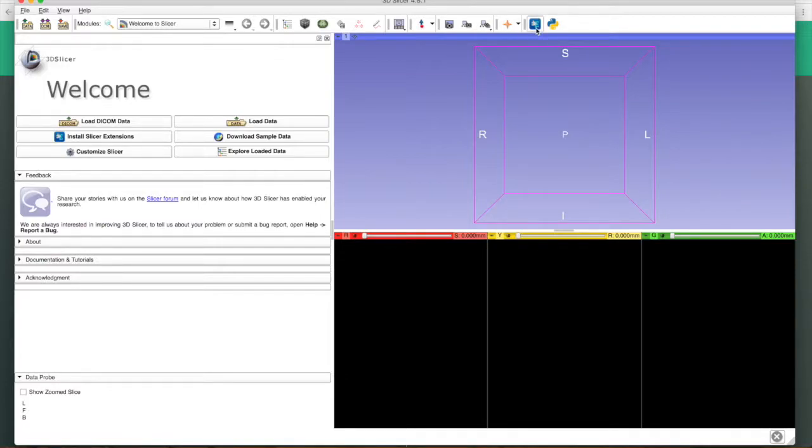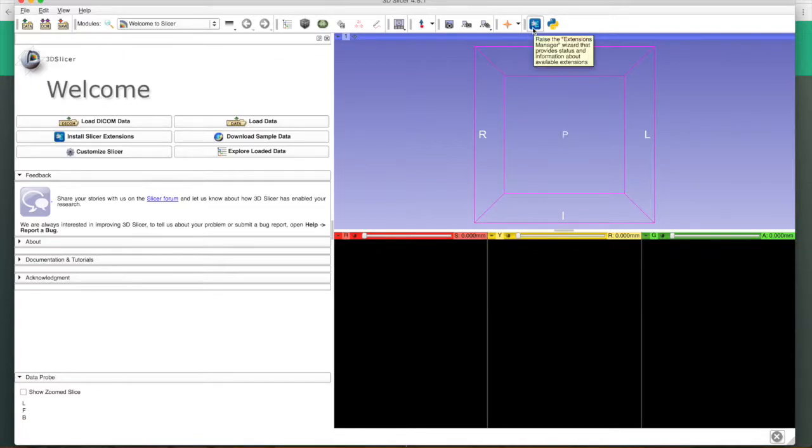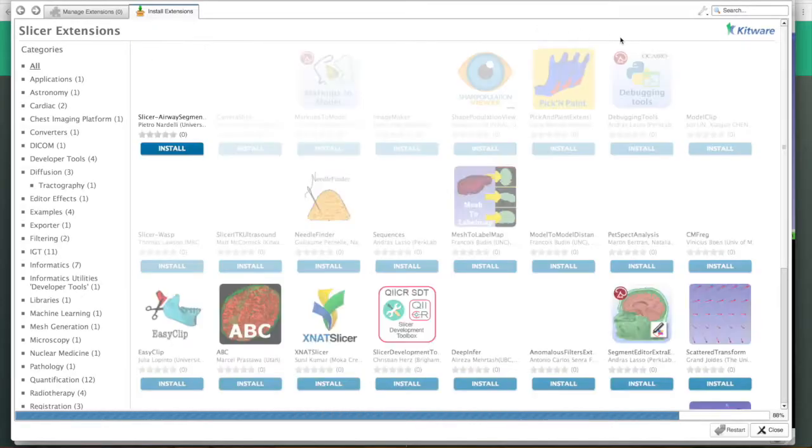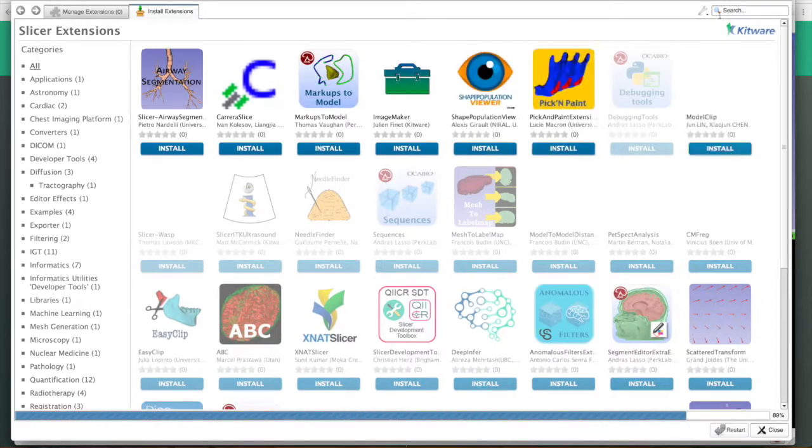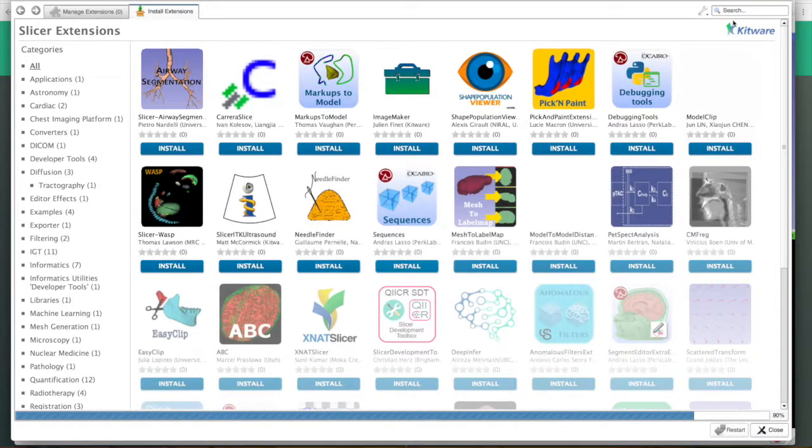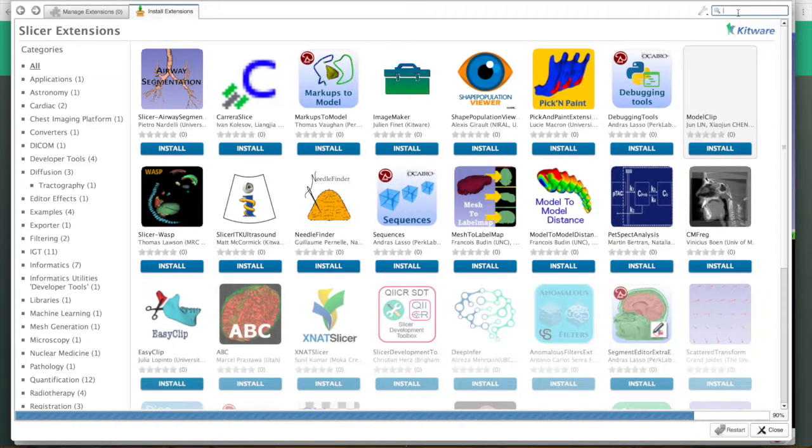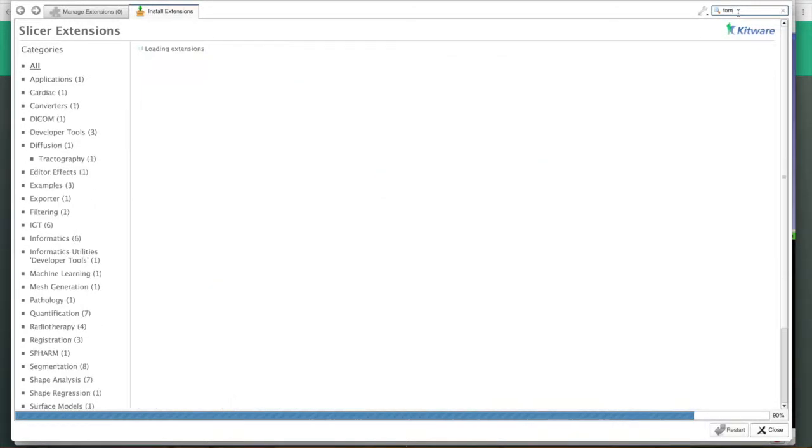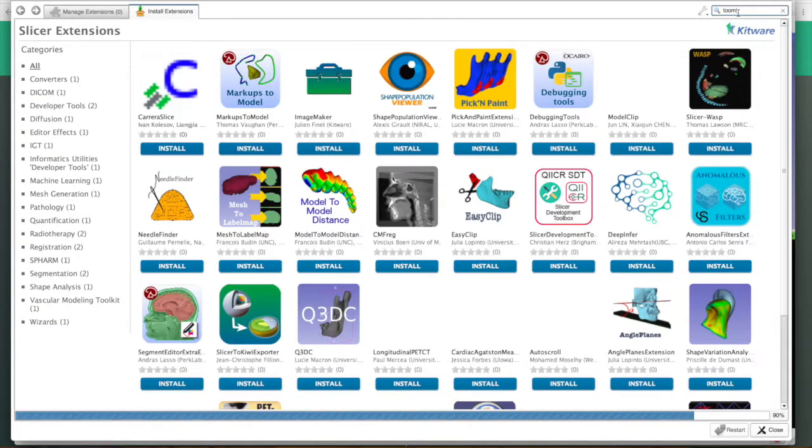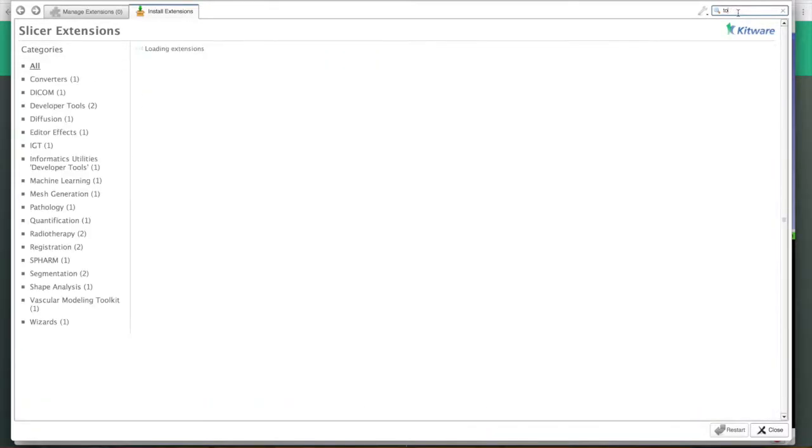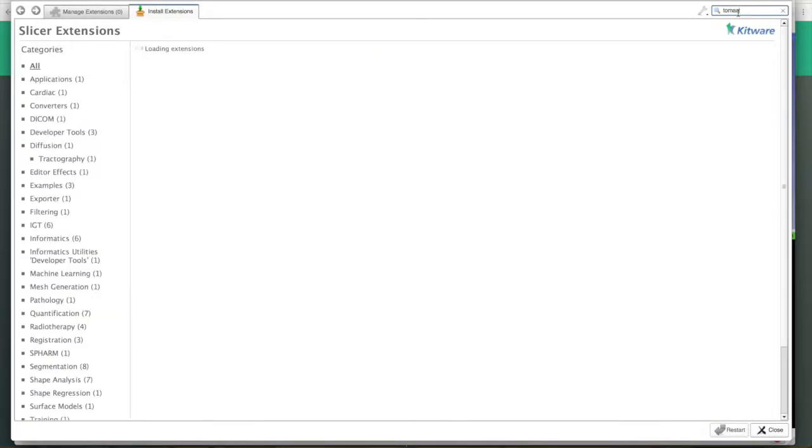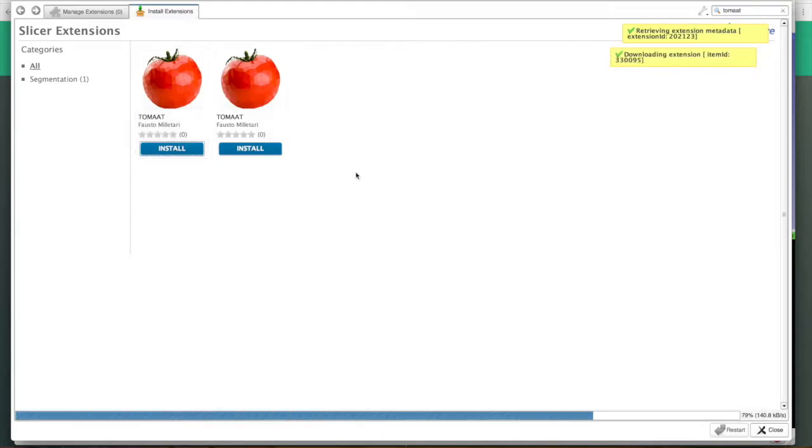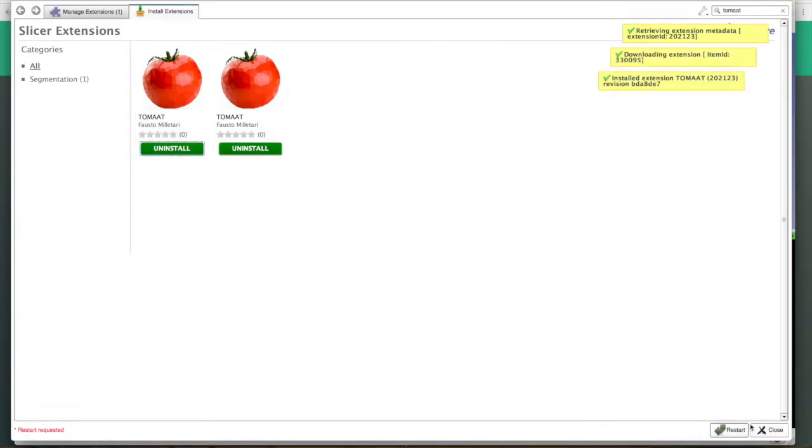We have coded an extension for 3D Slicer to realize the functionality of Tomat. To install it, we need to click on the extension manager, and then among all the extensions that are present, we have to look for Tomat and install it.